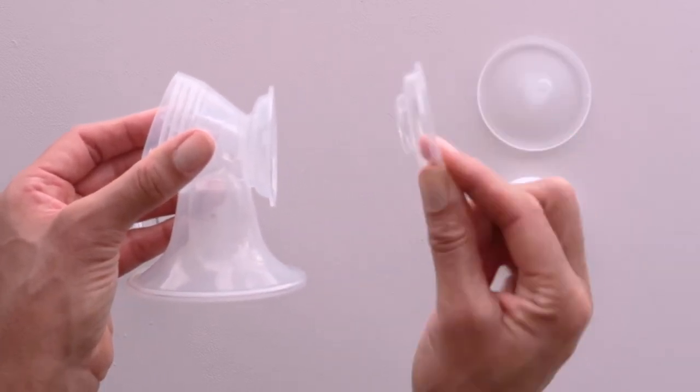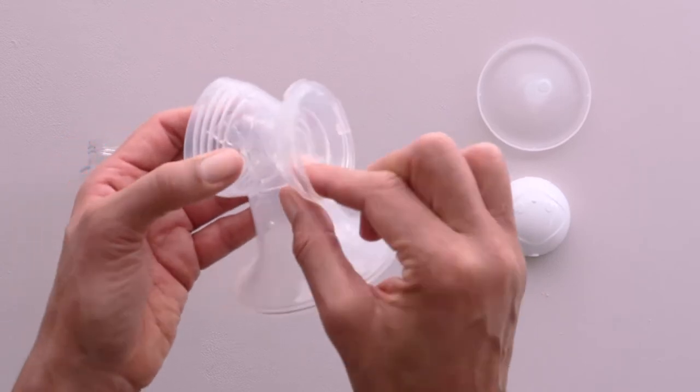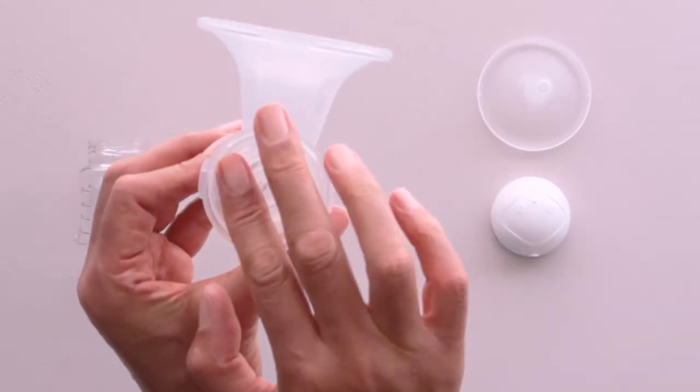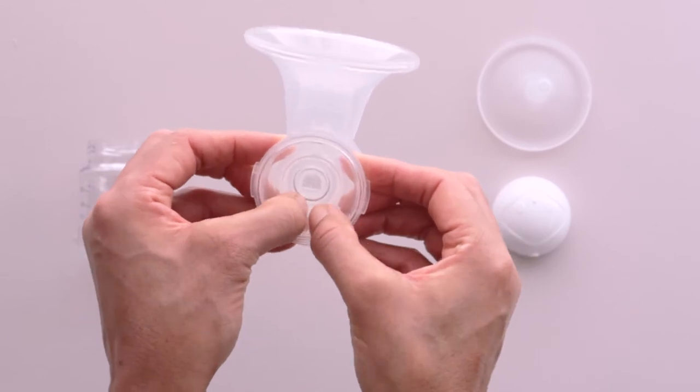This is the diaphragm. Carefully insert the diaphragm into the top of the breast shield body. Ensure the edge is flush and the seal is good.